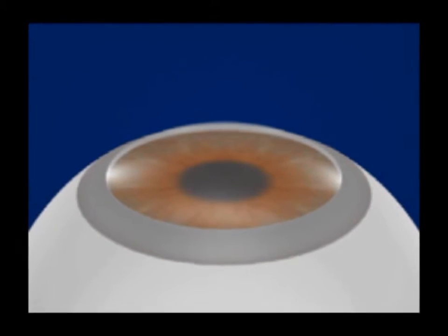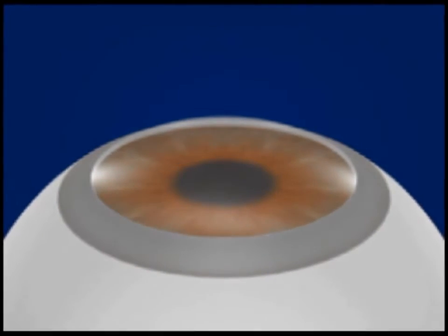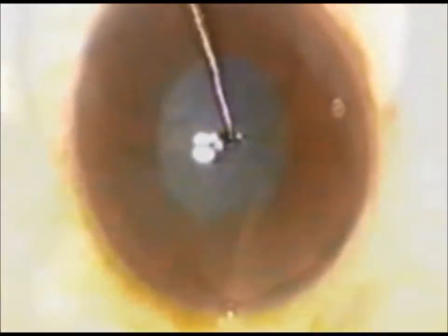With these surgical principles in mind, let's see an example of an actual surgery. We start with the preparation of the donor lenticule. Partial-thickness trephination of the donor cornea is done with an eight millimeter trephine.